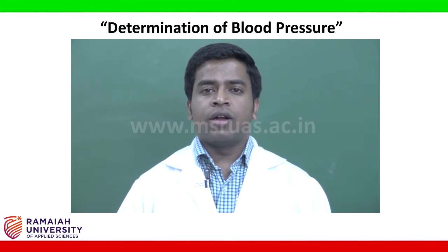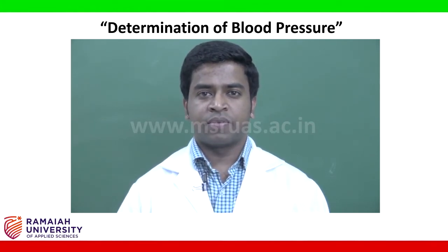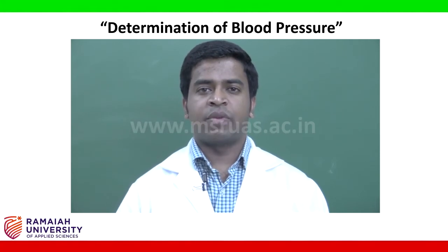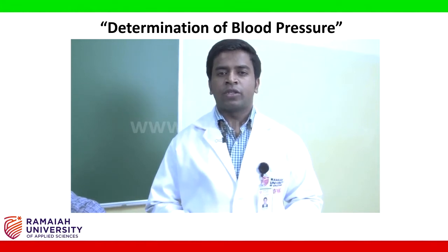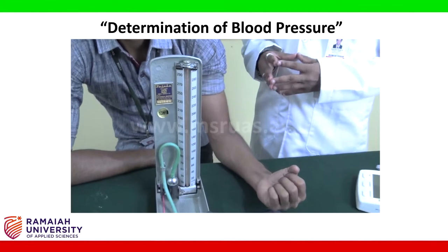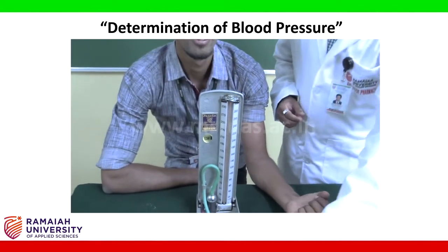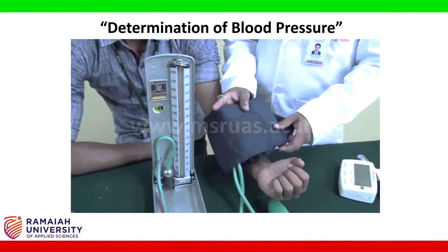First, record the systolic blood pressure of the subject using palpatory method, followed by both systolic and diastolic blood pressure are measured and recorded using auscultatory method. Now let us start palpatory method. Palpatory method must be employed before auscultatory method so as to avoid the auscultatory gap. First, make the subject sit in a relaxed position. Using the Velcro strips, place the arm cuff.